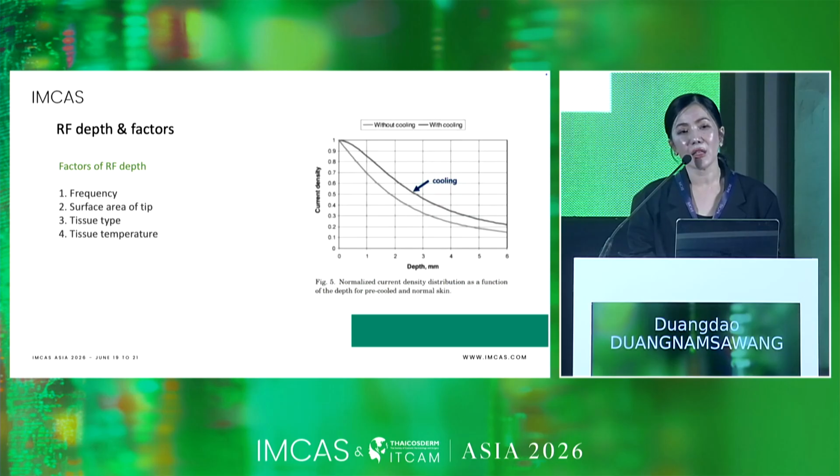The factors that affect the depth are the frequency, surface area, tissue type, as I mentioned before, and the last one is the tissue temperature. The graph shows that with or without cooling, the depth of the heating effect is deeper with the cooling.